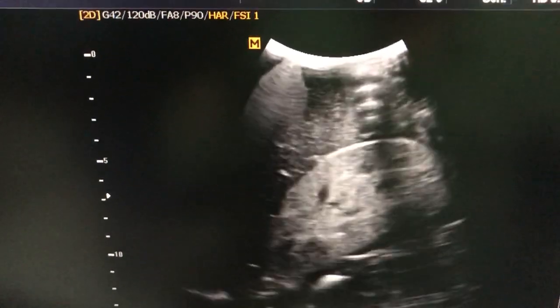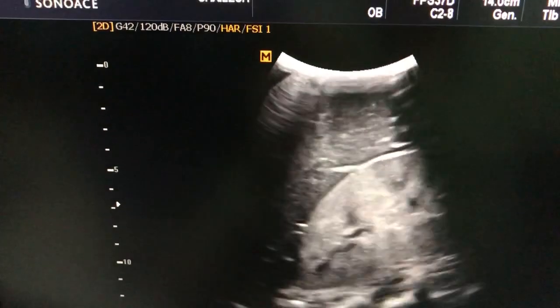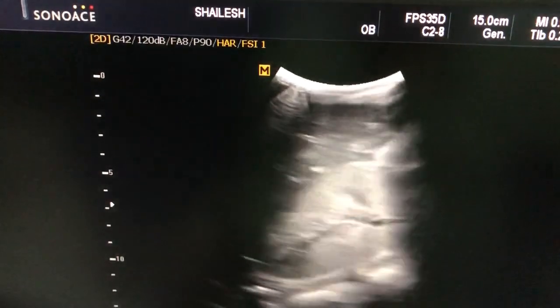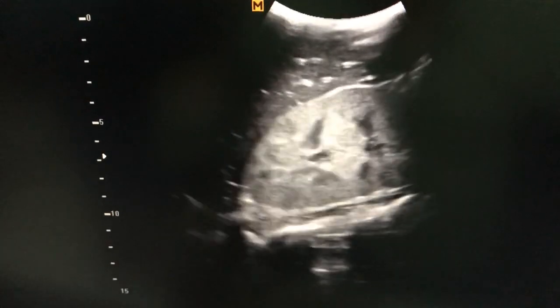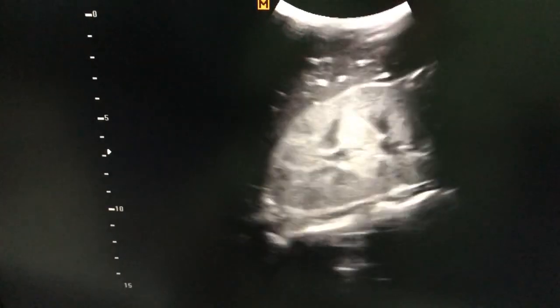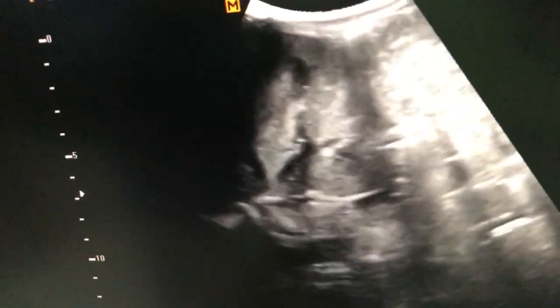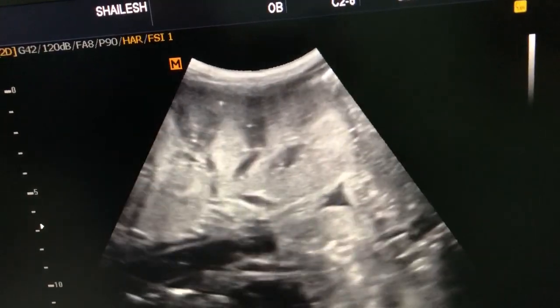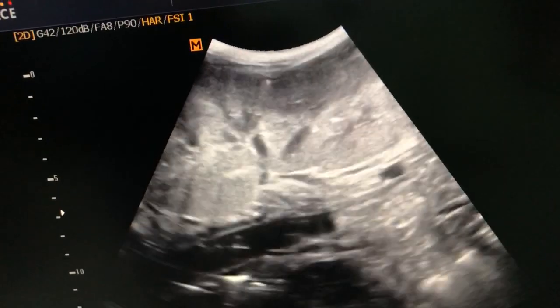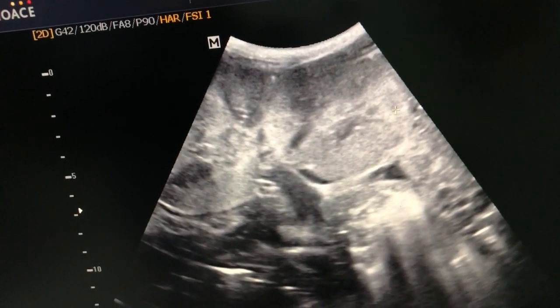Both the kidneys are severely hyperechoic, suggestive of acute kidney disease or acute renal failure. This is the right kidney — it is swollen, edematous, and hyperechoic with loss of corticomedullary differentiation. This is the left kidney, which is also hyperechoic, enlarged, and showing loss of corticomedullary differentiation.